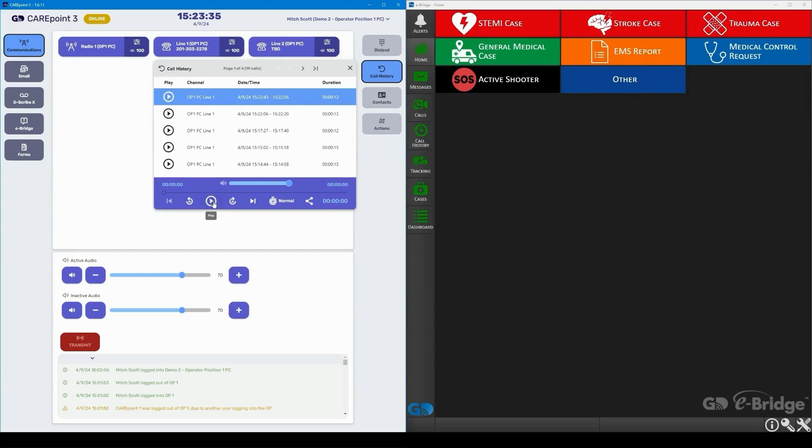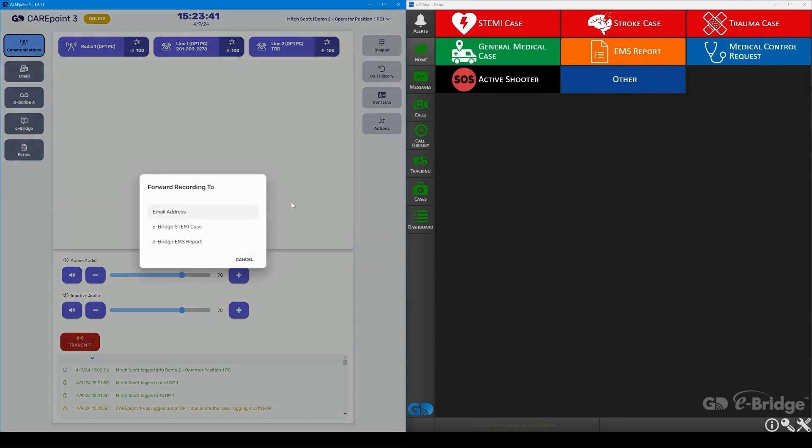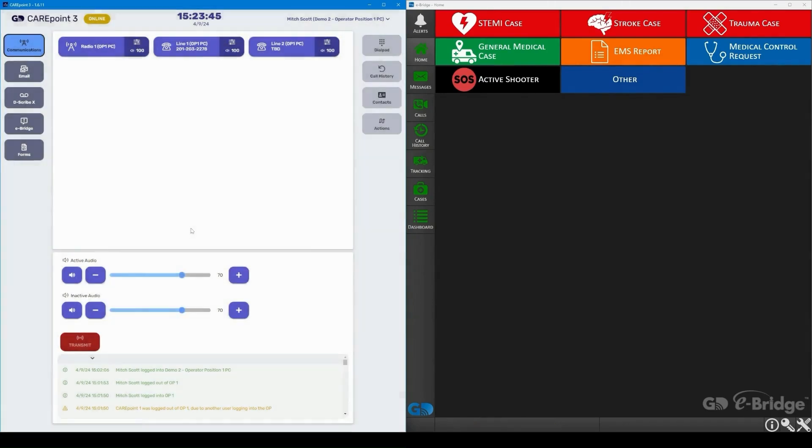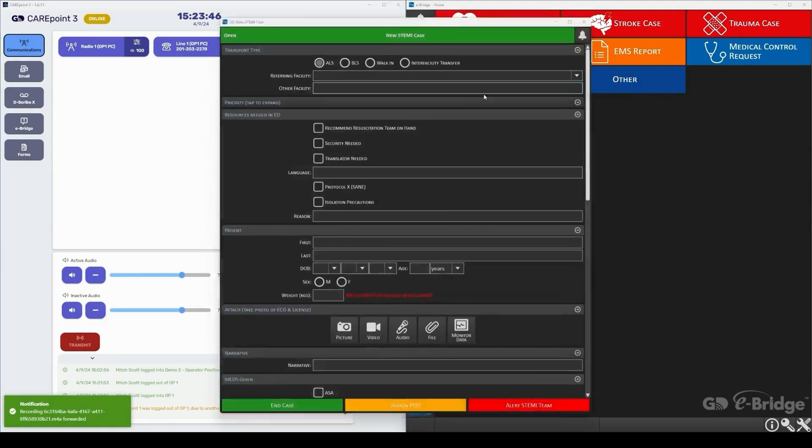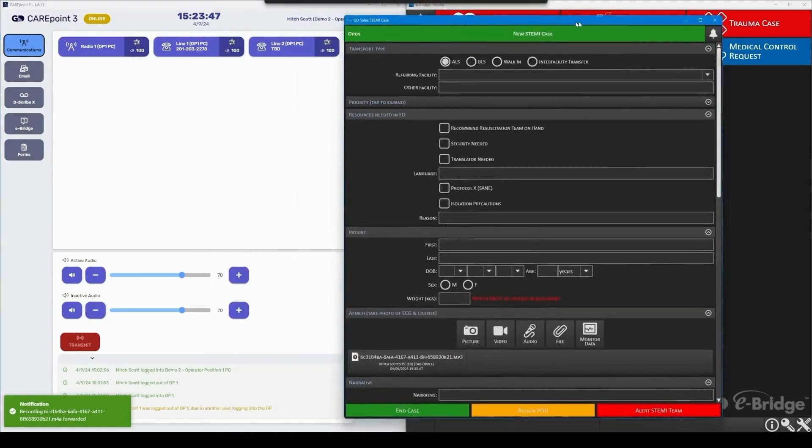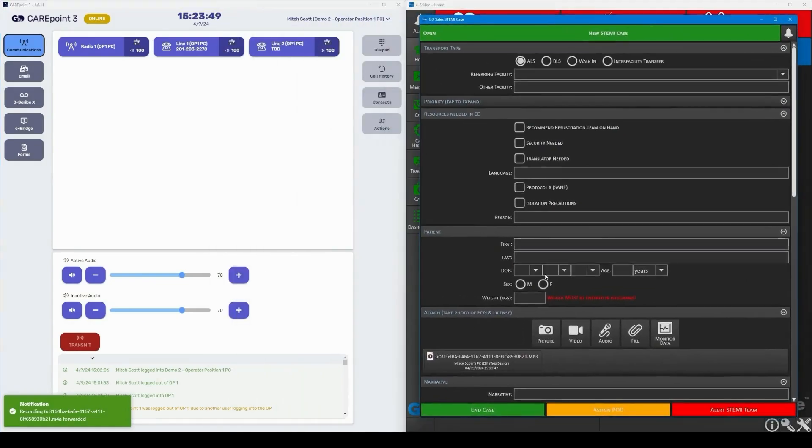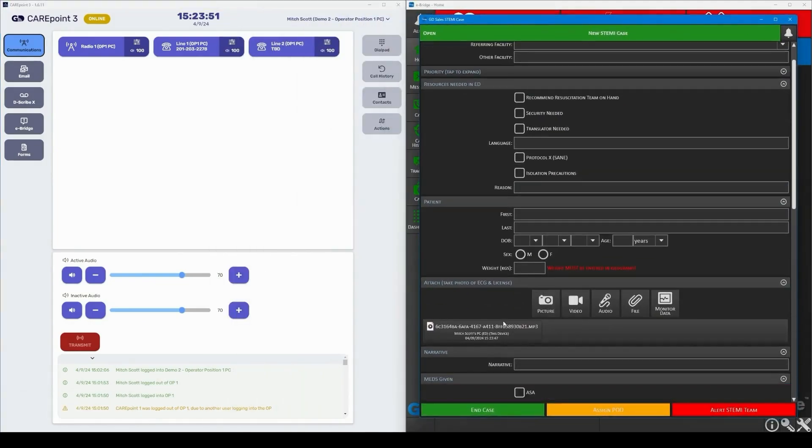For this case, let's just take this conversation recording and start an eBridge STEMI case and embed the call into the case. As you can see here, the STEMI case has started in eBridge, and the call is accessible to any of the teams included.